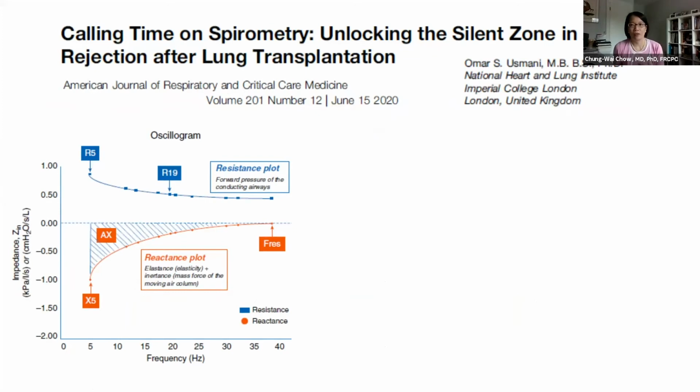And I'm forever grateful to Dr. Usmani, whom I hadn't met at that point, because not only did he provide us with the editorial, but he actually provided a primer to the readers on how to interpret oscillometry. And this diagram here is an oscillogram that I have copied from his editorial.